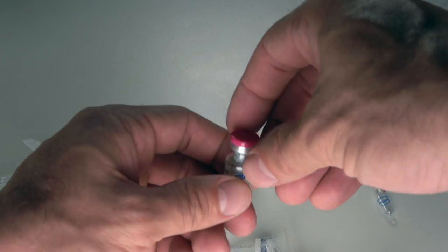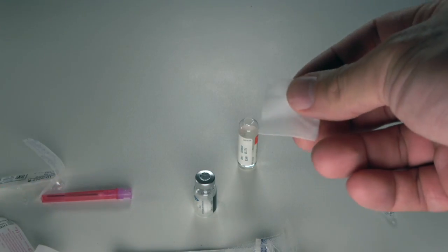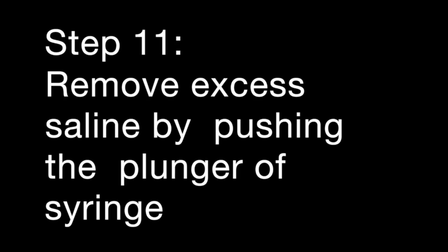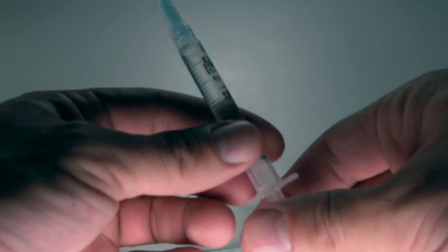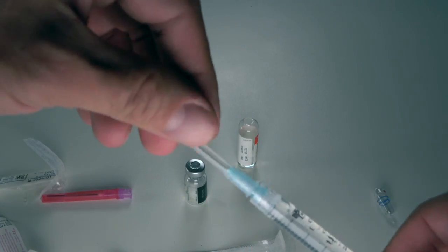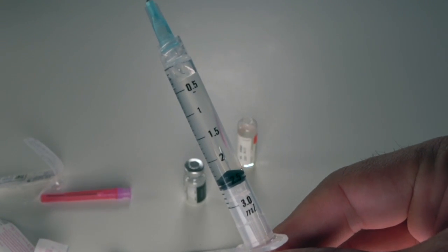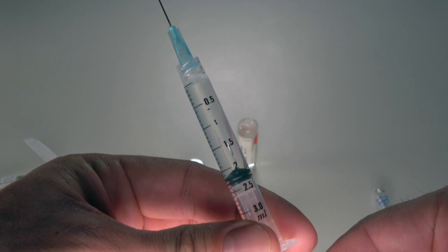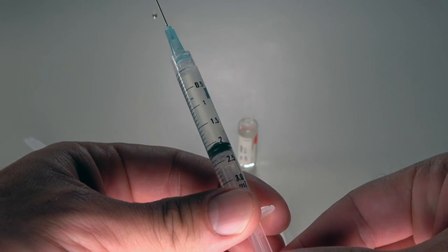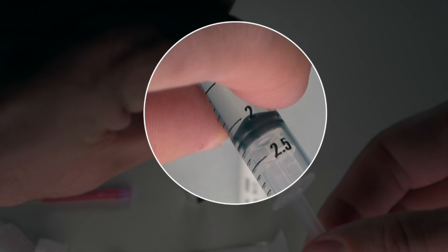Remove the protective cap from the HCG vial by lifting at the corner — it snaps off. Then wipe the top of the vial with a fresh alcohol swab. Now remove the cap from the needle and adjust the amount of saline in the syringe before adding it to the vial. For reconstitution, adjust to 2 millilitres — the number 2 on the syringe — by pushing up the plunger from the bottom, aligning the top line of the plunger to the 2 millilitre mark.